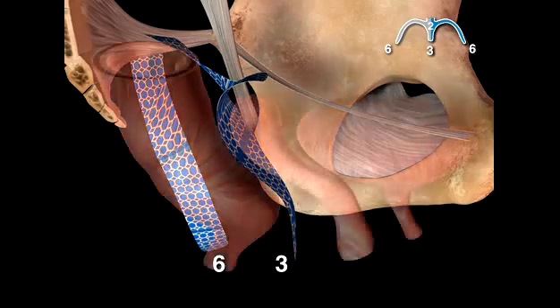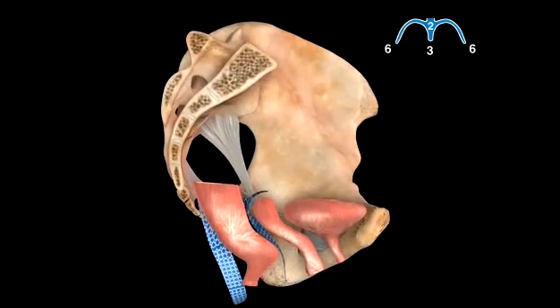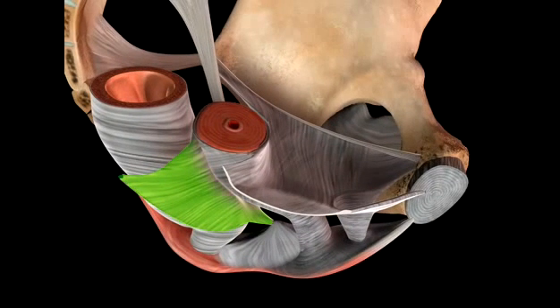With the need to repair a posterior vaginal wall prolapse with Gynecare Gynemesh PS, the mesh is placed in the true rectovaginal space between the rectal muscularis and the fibromuscular coat surrounding the posterior vaginal epithelium. This restores the support of the rectovaginal fascia from the apex of the perineal body to the uterosacral ligaments at the level of the ischial spines. The apex of the perineal body is located at the junction of the lower third of the vagina with the middle third.